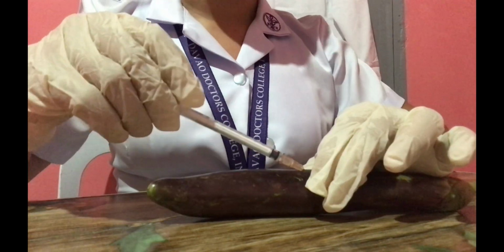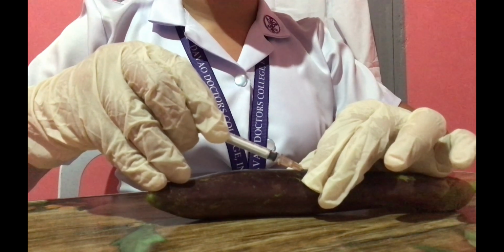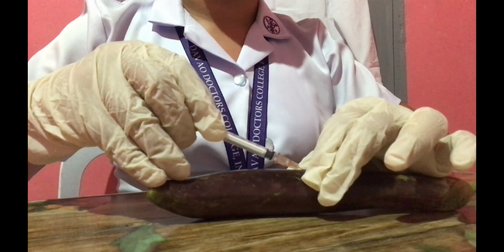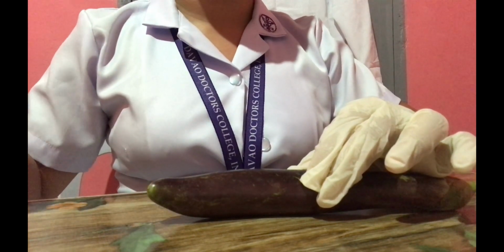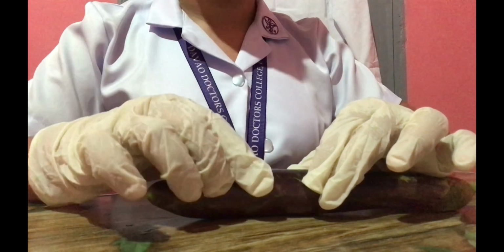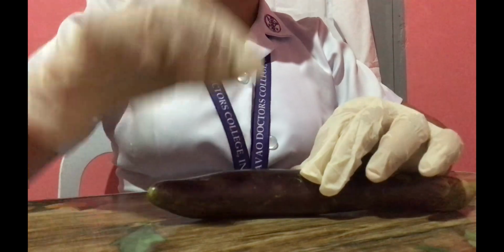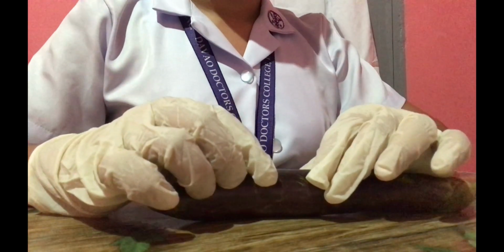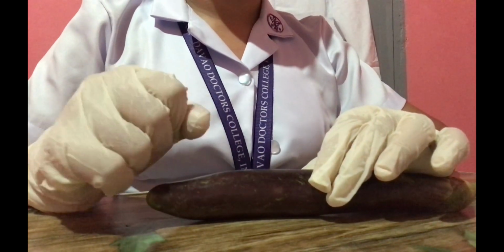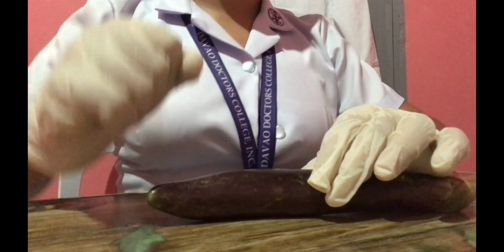Remove the needle smoothly, pulling along the line of insertion while depressing the skin with your non-dominant hand. After doing that, I am going to remove the needle smoothly at the same angle we inserted. If bleeding occurs, apply pressure to the site with dry sterile gauze or cotton balls until it stops.